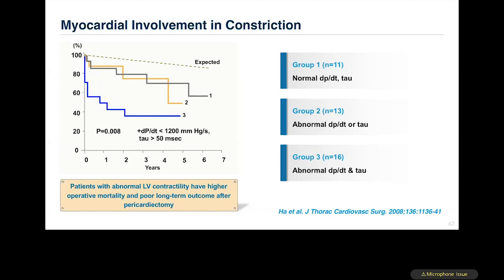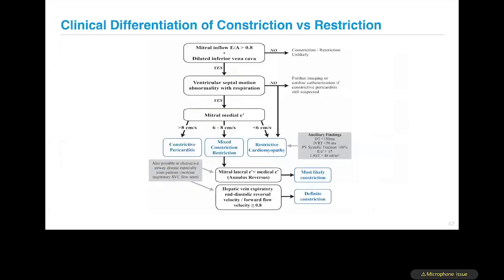And one has to be careful in understanding the reversibility of the disease after pericardiectomy. Some of these patients may not have good survival, particularly with the mixed disease, if pericardiectomy is done. So that could be a challenge, and therefore multiple modalities can be extremely helpful.